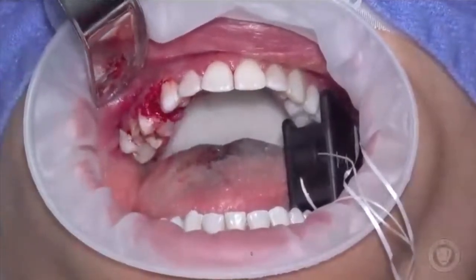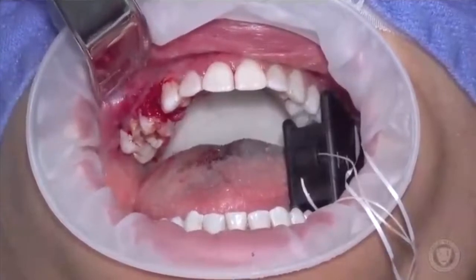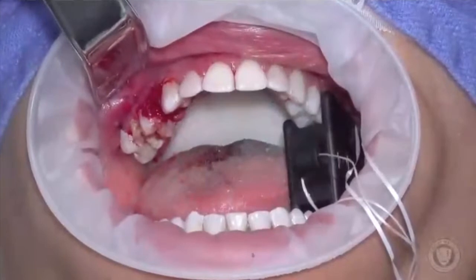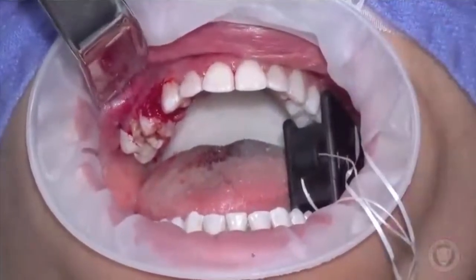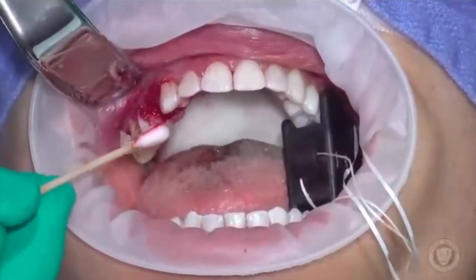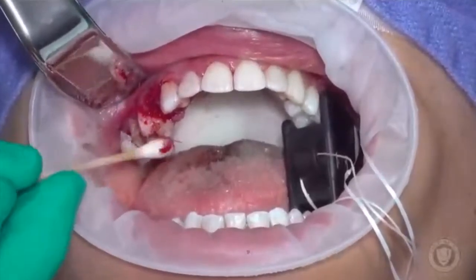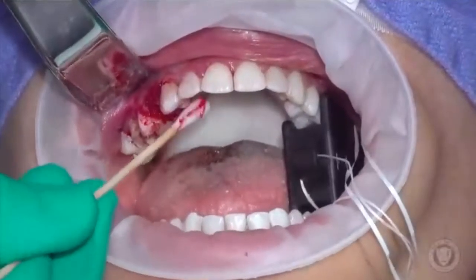What is the dry time? The Periacryl is water cured — it dries almost instantly. In fact, this little tag right here, do you see that? That's a piece of glue that's already dried right there — it just fell off. So it dries really, really quickly.